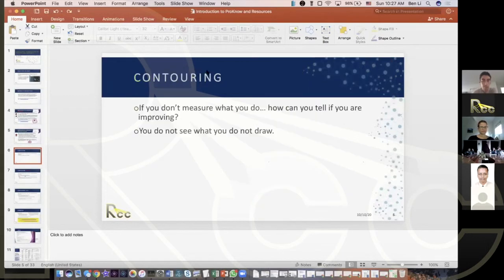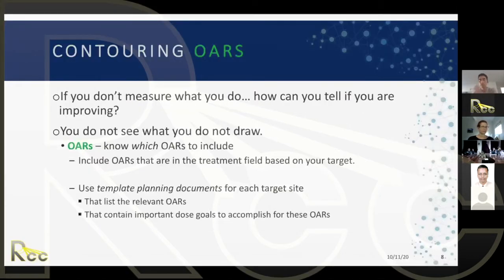Good. So I'll answer the question more as we get later on. Dr. Vistun, I'm going to make the screen big again. On the topic of OARs, we just saw one case and some of the OARs they included. There may be some other OARs which I would include. Really, which OARs you include depends on what site you're treating and what OARs are in the treatment field that you're performing.